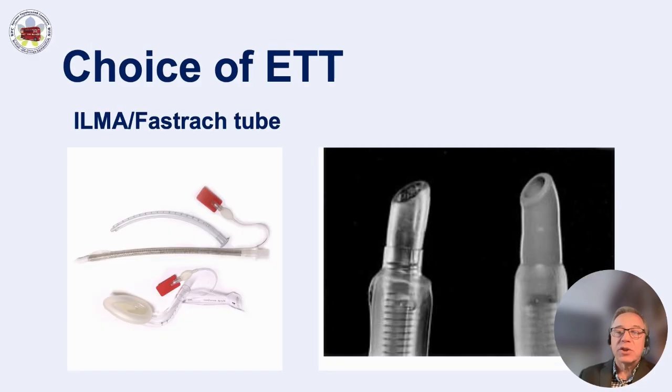However, my best tube, if your patient is really, really tricky, comes from the set of the intubating laryngeal mask, or Fastrach, and that is the tube that comes in the set. The best bit about this tube is the Huber point. I compare it with the pencil point spinal needle. The tip of this tube, unlike the traditional 45 degree bevel cut tube, like your Quincke needle type thing, goes over the scope nice and easy. So that is my best tube that I would use. It became difficult to obtain this tube, but I keep some in the drawer for real emergencies.